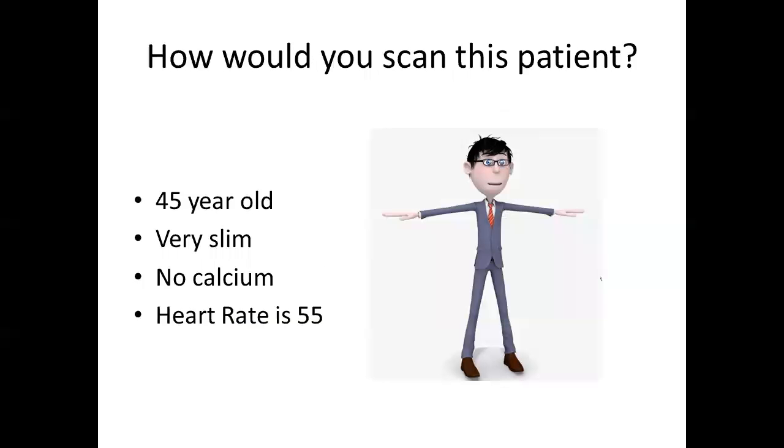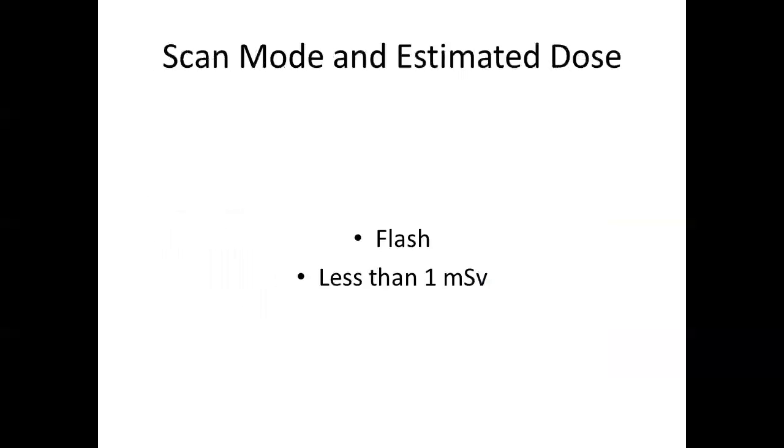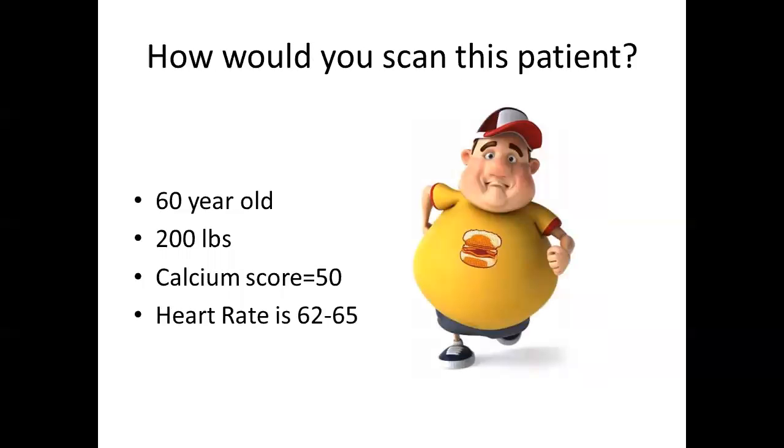Flash? Okay, all right. So you guys were listening. Okay. So this is your perfect patient. You're going to flash this guy. And then usually you'll get less than 1 millisievert, which is great.